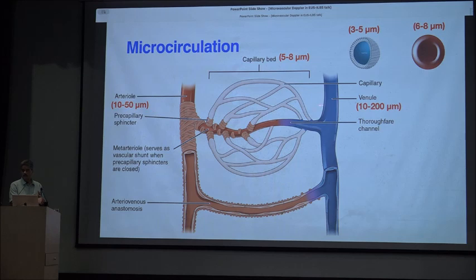So this component of the vasculature constitutes the microcirculation, which is the goal of today's imaging and has a huge number of applications. Lymphatics also should be counted here. Now, for reference, I give you the size of a RBC, which is 6 to 8 micrometer. And this is an ultrasound bubble, which is 3 to 5 micrometer in size.